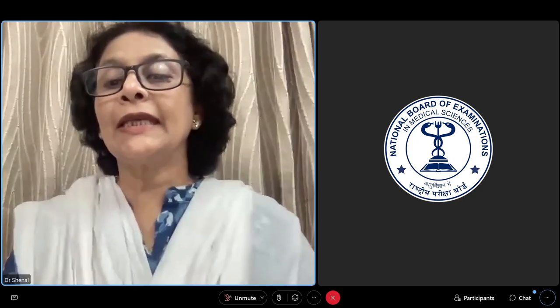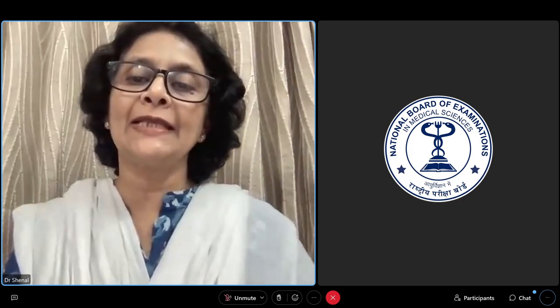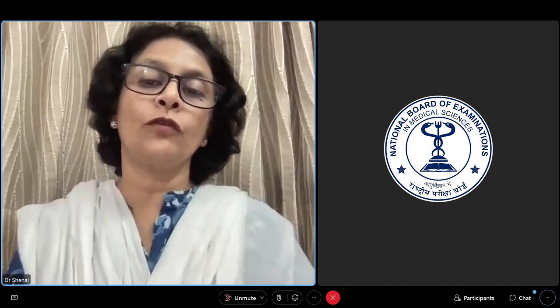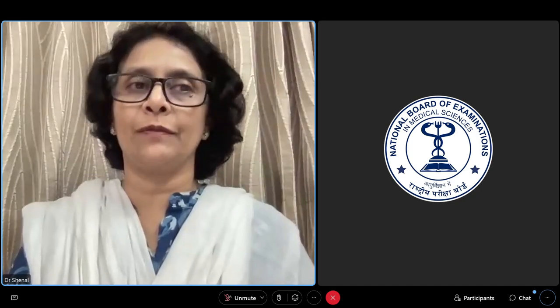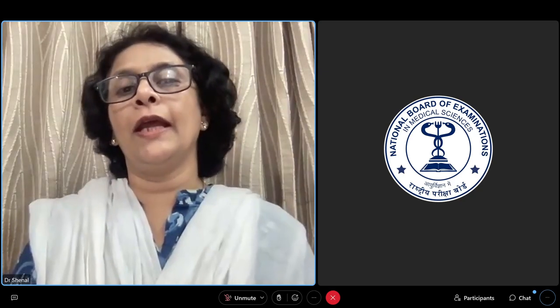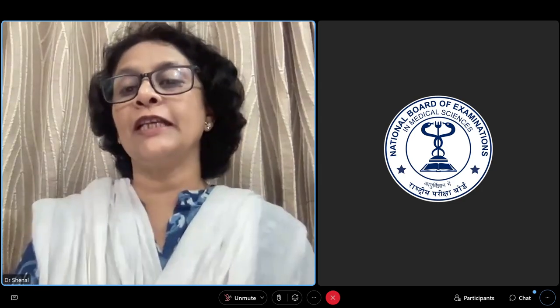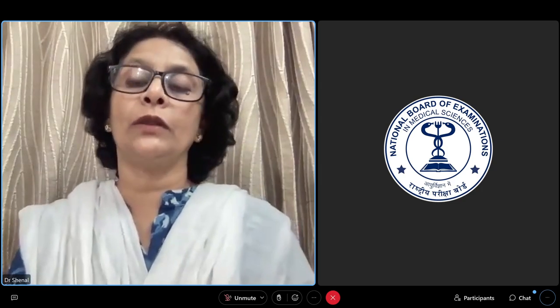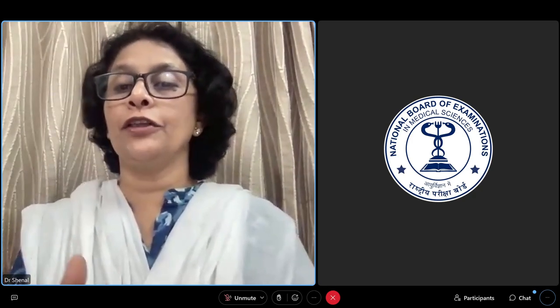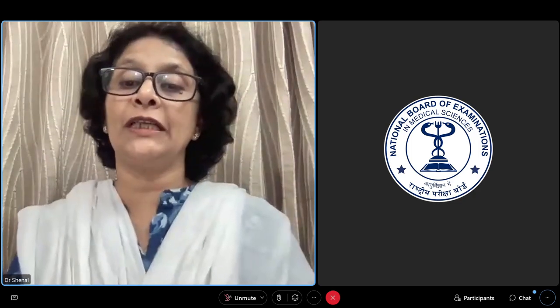So yes, candidacy criteria, I've already explained in one of my slides. For children under the age of 3 years, we'll assess them through the various audiological assessment tests, the main being the OAE and the BERA, then accordingly we'll proceed. And for adults, if their speech discrimination score is below 30, then we'll have to work up with the candidacy, like radiological investigations, and whether the loss is cochlear or retrocochlear through the audiological test.